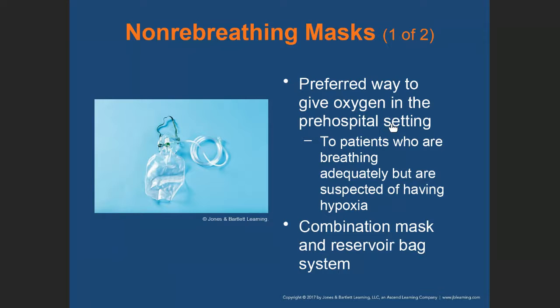If it's a non-rebreather and the oxygen finishes, it can suffocate the patient. It can form a complete seal on the patient's face. The other situation in which we will use a partial rebreather is if the patient is having a panic attack. So if they're having hyperventilation syndrome or a panic attack, they're breathing very fast because they're nervous, or they got bad news or anything like that. It's causing them to breathe very fast and they're not controlling their breathing, so they're hyperventilating.